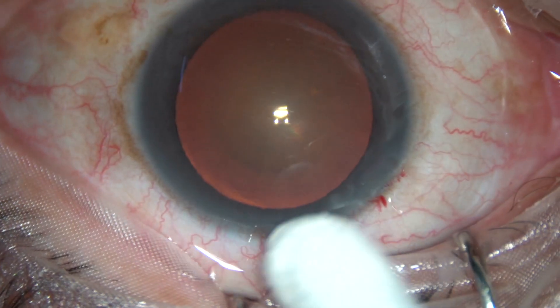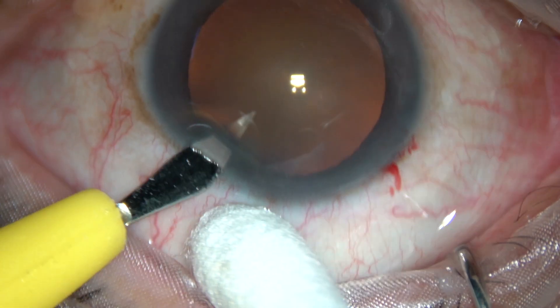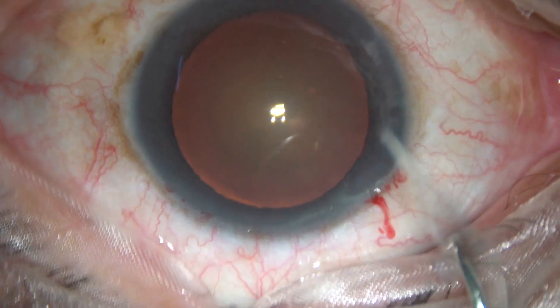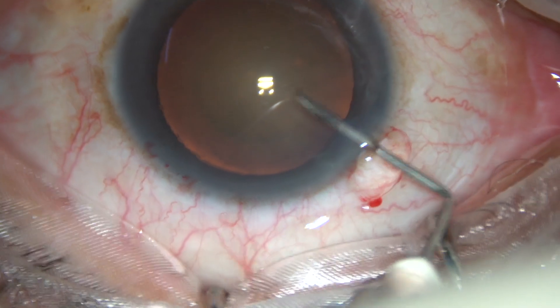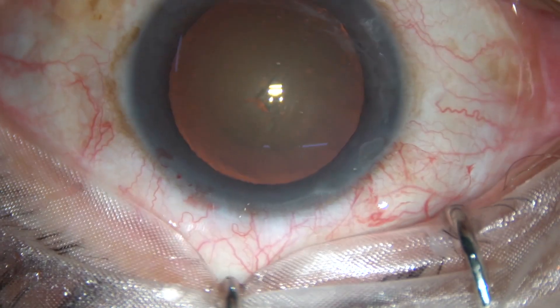You can see this is a cataract with grade 3 nuclear sclerosis. This is a side port on the left side of the main incision and now a capsular tag is raised. This is a 26-gauge bent needle.